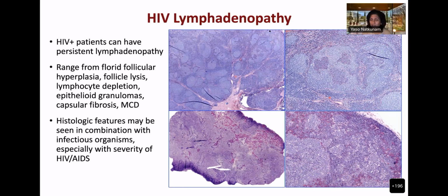This can actually be a very helpful marker in so many things. In the follicular lymphoma case that I showed you, the entire lymph node was clearly follicular architecture, but you can also have diffuse architecture or things that are partially follicular with progression. So CD21 can be very helpful to show you that there is a disrupted follicular architecture.